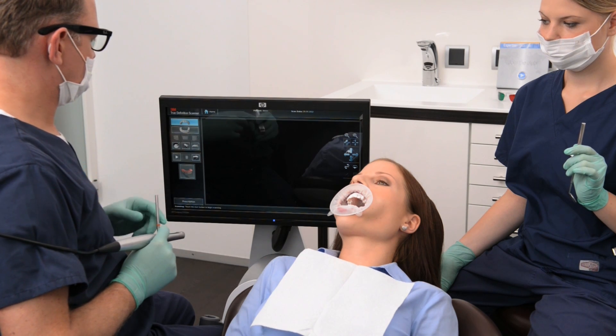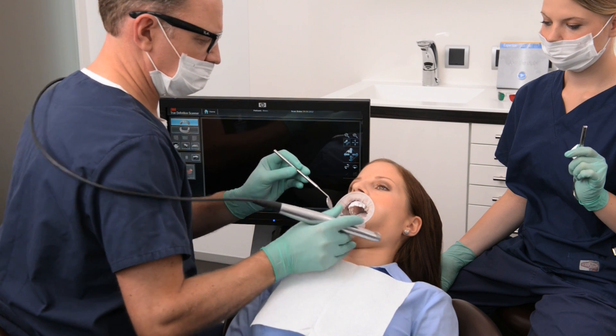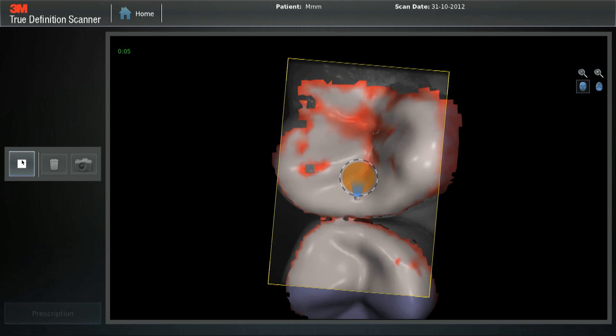Scan opposing arch. Start on the occlusal surface of the tooth directly opposite your prep. Only scan the teeth you need for the bite registration.